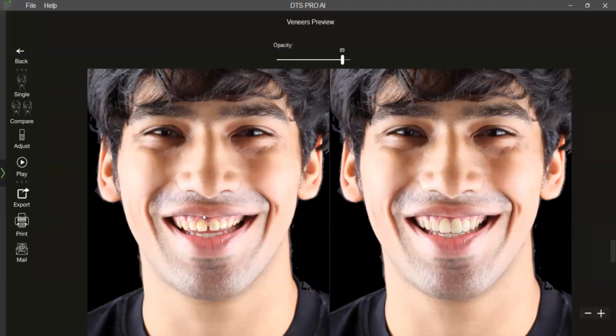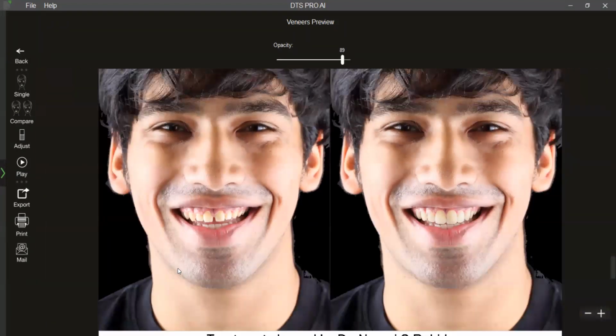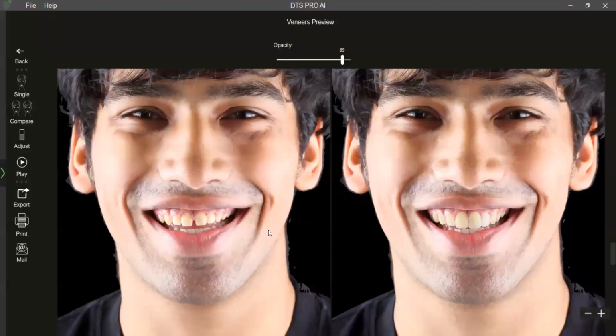We start the workflow by shooting a single photograph. Now, in this particular case, because I am able to visualize even the gingival part quite well, I am not too bothered about having a separate retracted image. But if I have a patient with a very low lip line where gingiva is just not visible, and you still want to just stop at the motivational part, you need not go ahead and shoot the retracted image. Just a photograph, motivate the patient, stop it there.